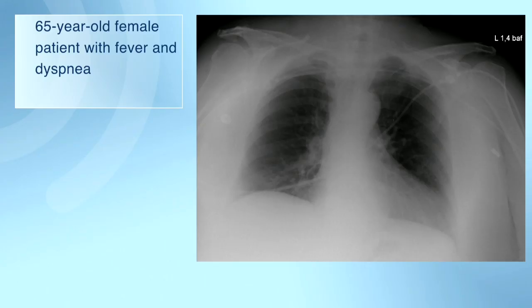I was asked to give you a very brief introduction on imaging in COVID in general, and I will walk you through two typical cases. Before that, just to remind you, chest radiographs are not the way to go. The sensitivity of chest radiographs is very limited, and even more so the specificity. So if you are in doubt if a patient has a COVID-19 infection, maybe you have no access to RT-PCR, you should go to CT and not chest radiographs.